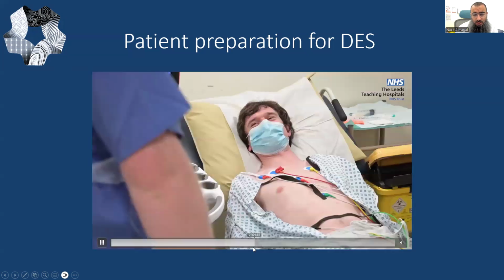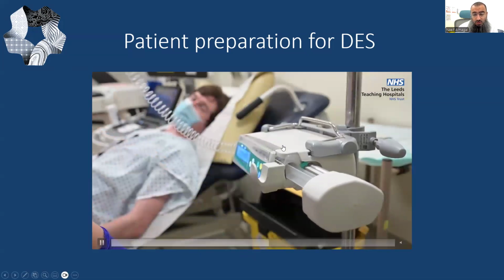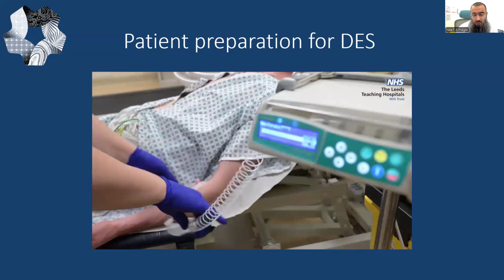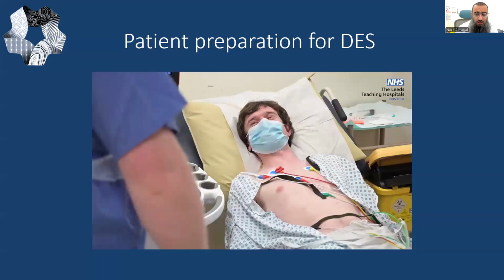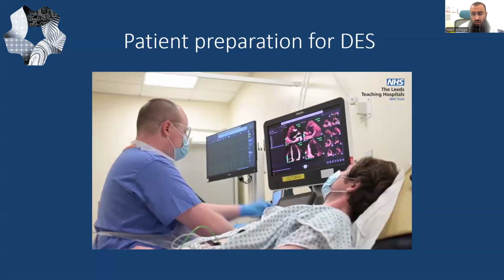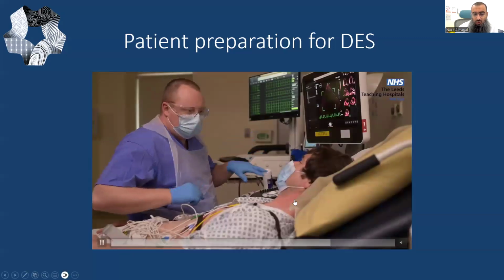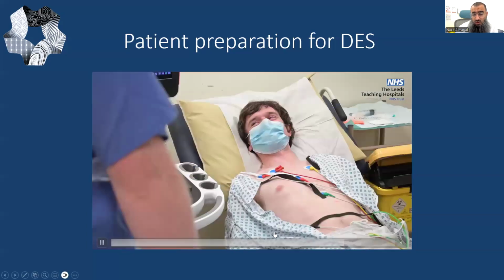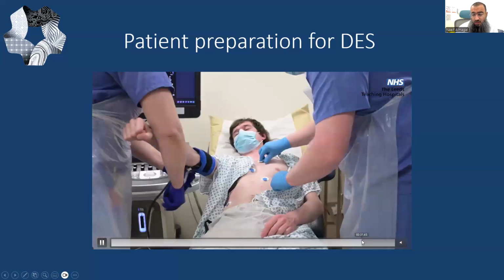It's very important to explain to the patient what to expect during the stress test and what possible side effects might happen. Usually we use the pump IV access, or pump infusion, to deliver the drug and to increase the dose of the infusion based on the followed protocol. It is very important to reassure the patient and stress on the possible side effects he might have, informing him about the outcome of this study, and reassure him because it's similar to other procedures. One of the things that we keep following during the test is the ECG along with blood pressure monitoring throughout the study.